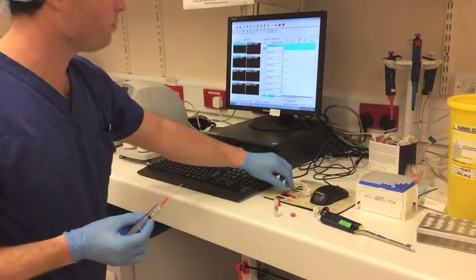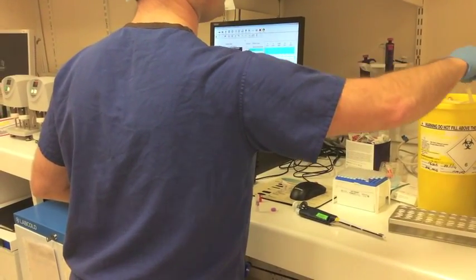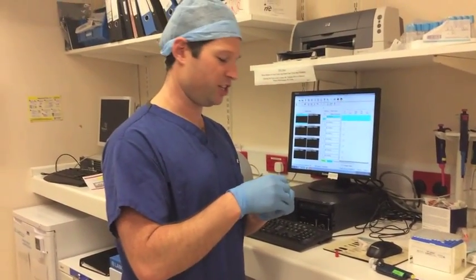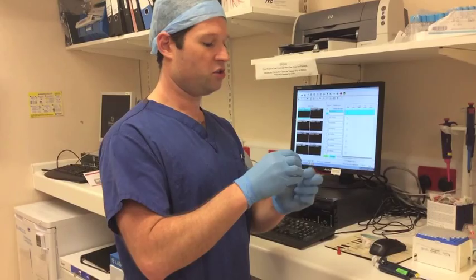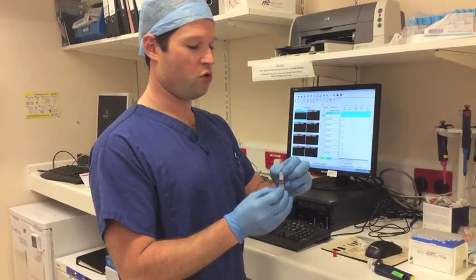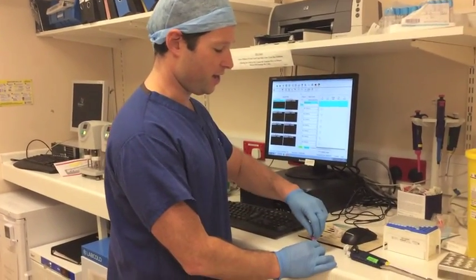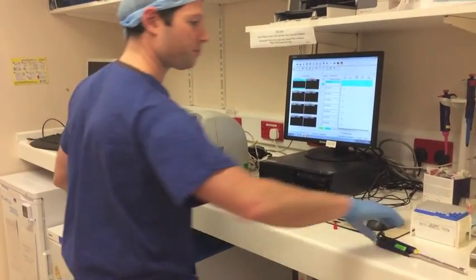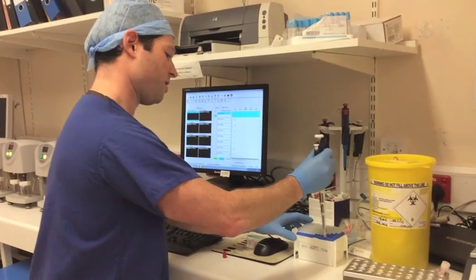That is filled to one ml. We'll then discard our needle. This then needs to be gently agitated with five gentle turns: one, two, three, four, five. This mixes the blood with the kaolin, which is going to act as our activator. We're then going to come to our TEG machine. We need to now insert our pipette — all we need to do is take a pipette.